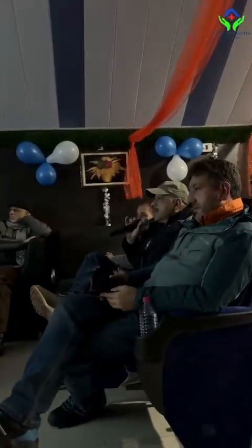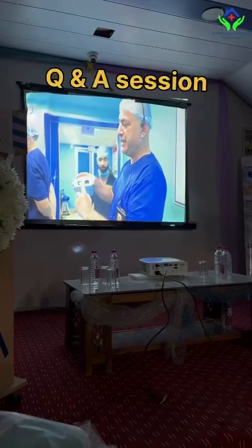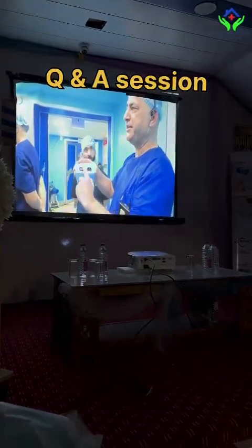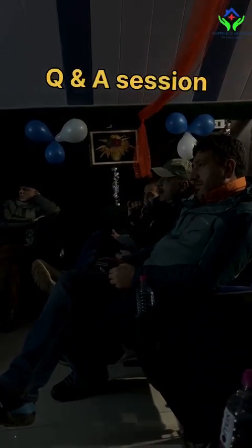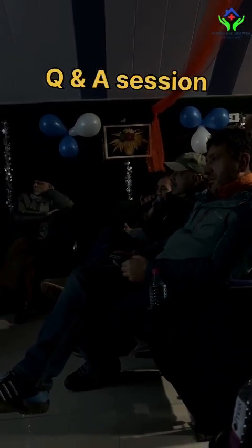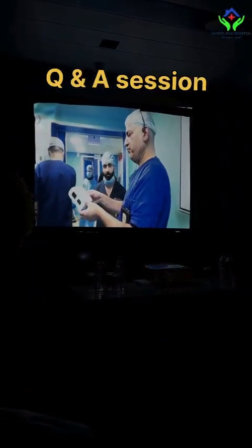And is it battery operated? It is not battery operated. I think it has got cells inside. No cells. Dry battery, or we need to connect it to a power source? Okay, you can see this plug. This is for the energy source, electric source, or power supply, and this is for the output. Yes. For the piezoelectric crystals, this machine will convert the electrical energy into ultrasonic. That is called the piezo crystals. So a beautiful innovation, I would say, because with the harmonic, you need to carry that big thing and all that. Very true. And I'm sure in future they may get it dry battery operated, because the way technology is growing. Yeah, I'm sure in future we'll have the same thing with an inbuilt battery.